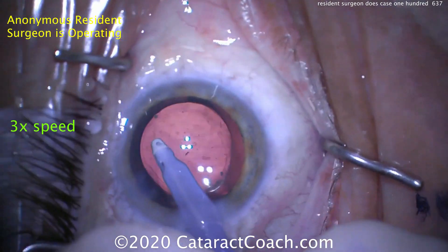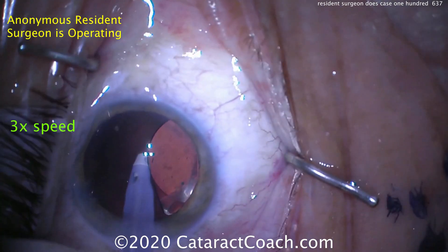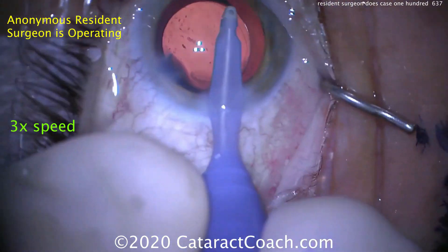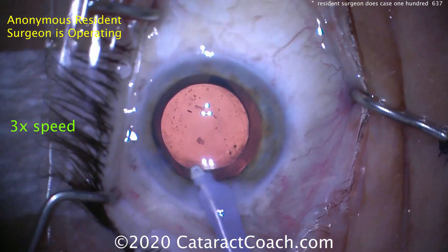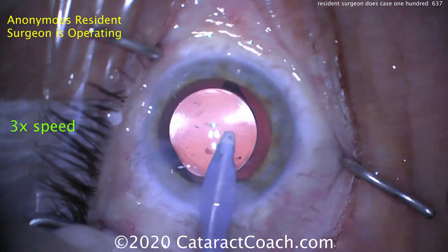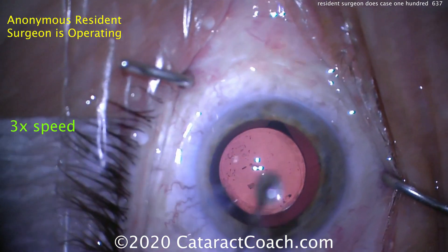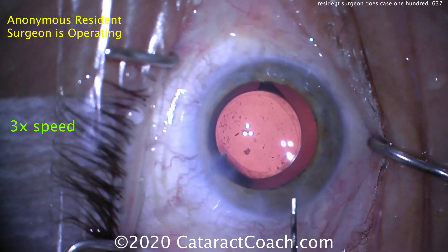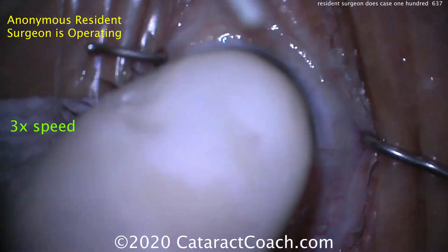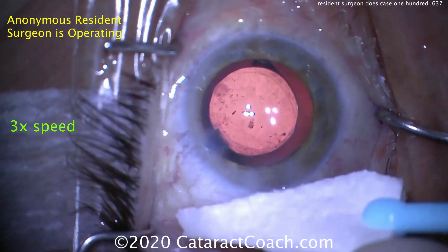Now going to remove all the viscoelastic from the eye — going behind the lens. You may notice that there are a few small pieces of nuclear chunks or chips in the anterior hyaloid face. Those are not behind the optic in the bag — they're behind the posterior capsule. That can happen in cases where there are loose zonules, and some of the tiny little cataract fragments as we take out the cataract can go into the anterior hyaloid face. Those will absorb with time — not such a big deal.